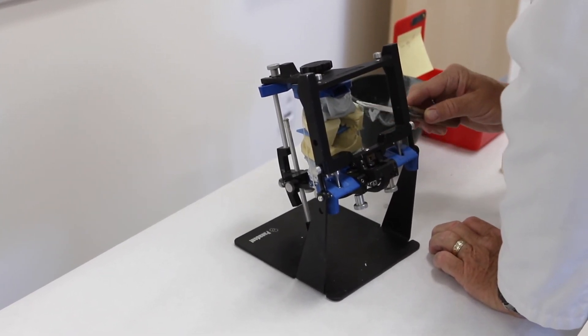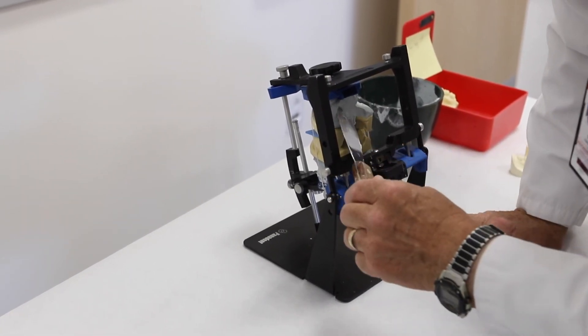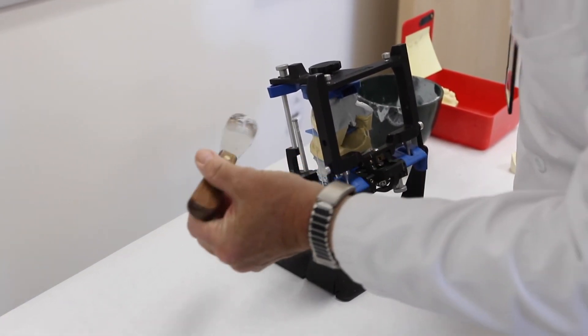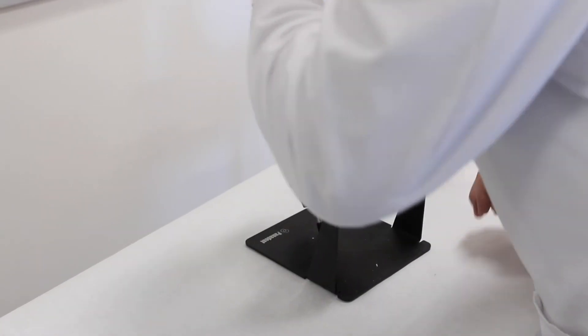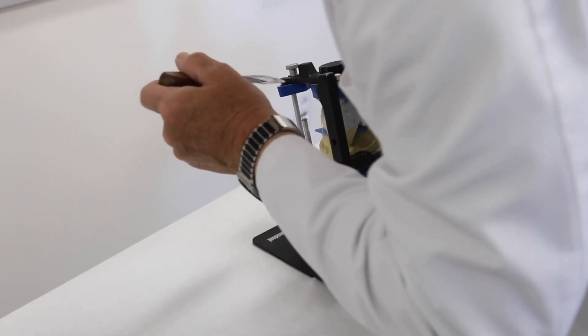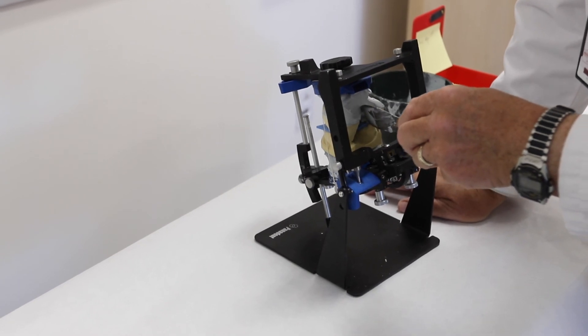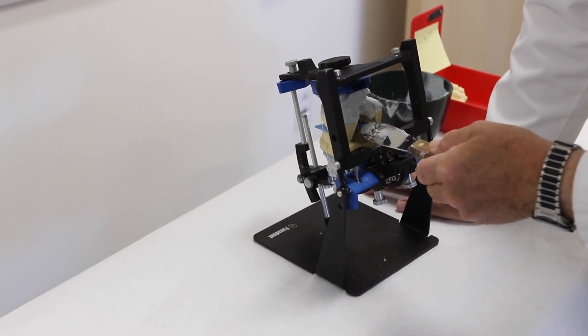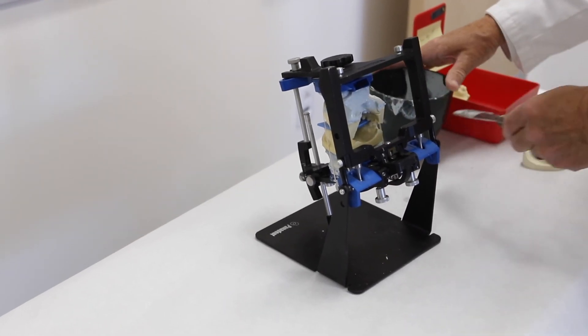Again you can clean up any excess that overflows and bring it into the indexes that you made. Generally your elastic will hold it in place while you do these minor corrections. Again it's important where possible to avoid getting excess blue mounting stone outside of the borders of the lower model.